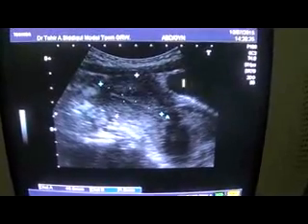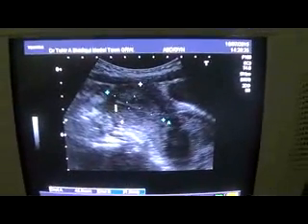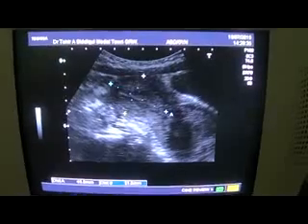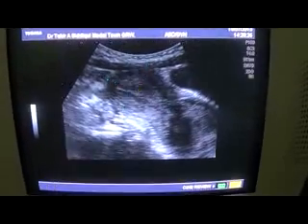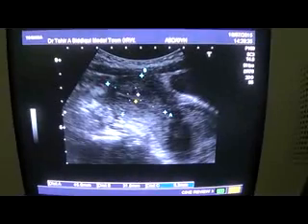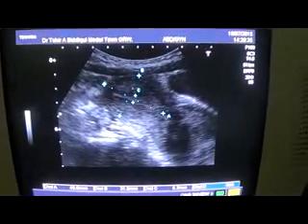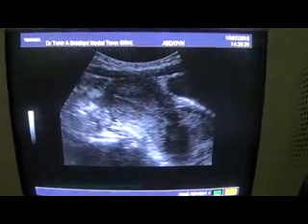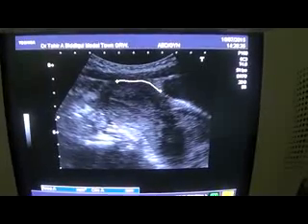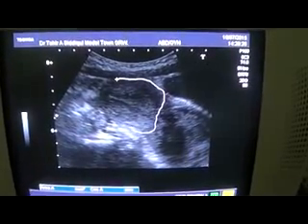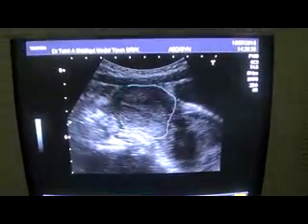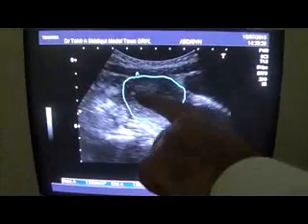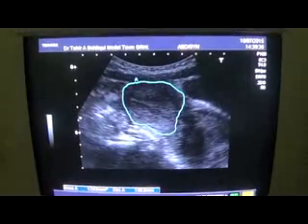This is the urinary bladder, and this central echogenic linear area is the endometrial canal appearing to be in the proliferative phase in this scanning plane. If I make a trace of it, this region is suggesting us the body, cervix, and the uterus, with this central echogenic line representing the endometrial canal.